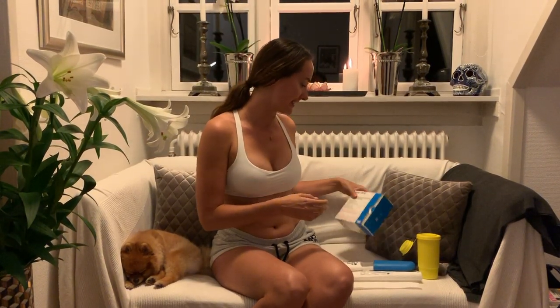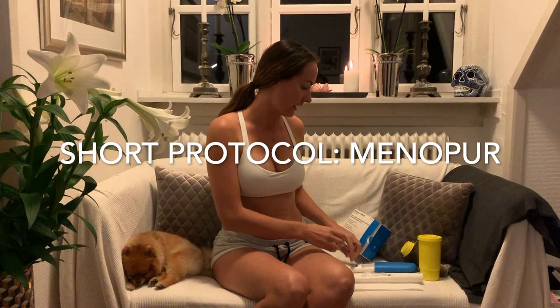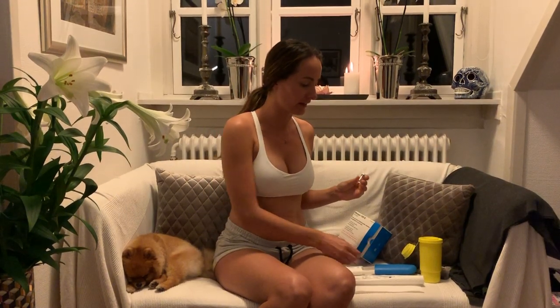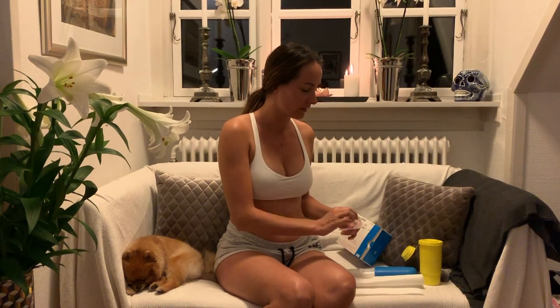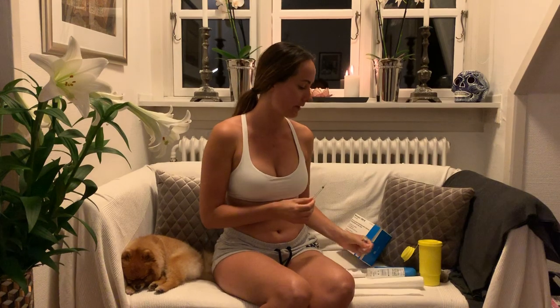Today I'm going to show you how I do my IVF injections. I don't particularly like needles, so I'll do my best. I have this Menopur 1200 units and I have already done the mix. Just make sure you have everything ready so it's easier. I have the syringe — remove the cap like that.